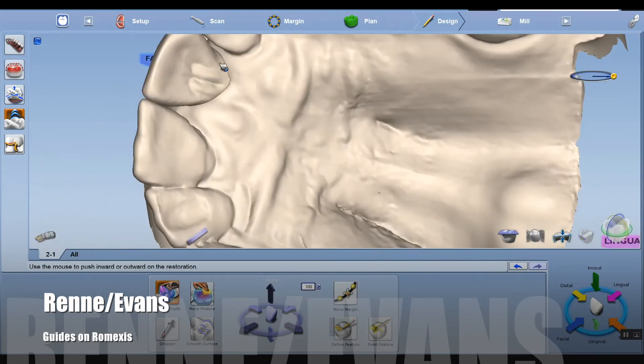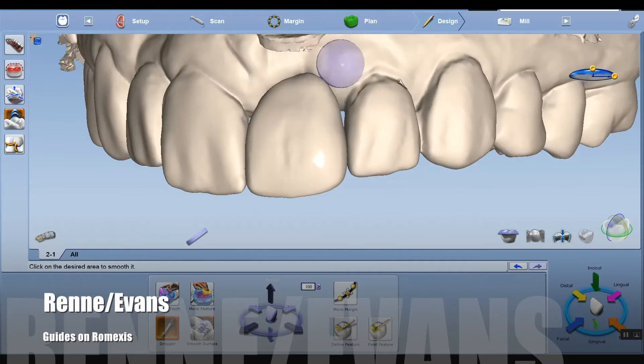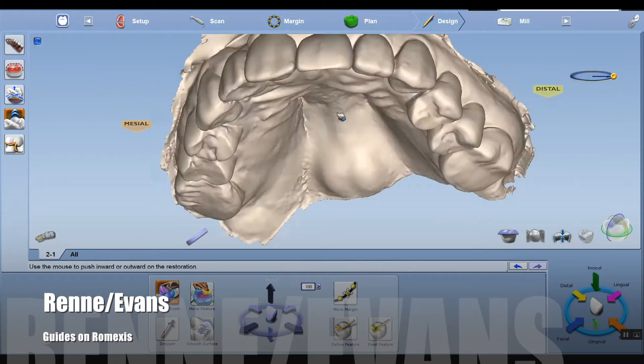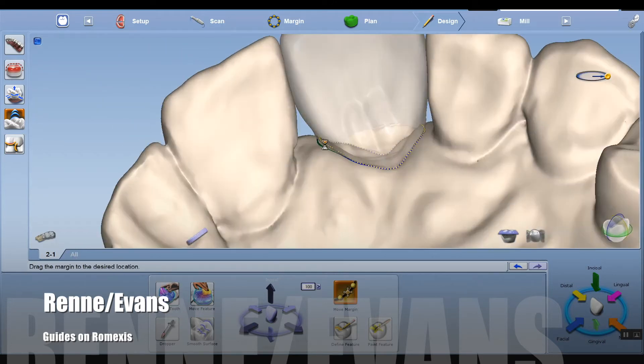One thing you'll notice is that it looks like the tooth space is a little bit bigger than tooth number eight. So what I'm going to do is throw this into smile design to show the patient that the final aesthetic result might be a little less than ideal.